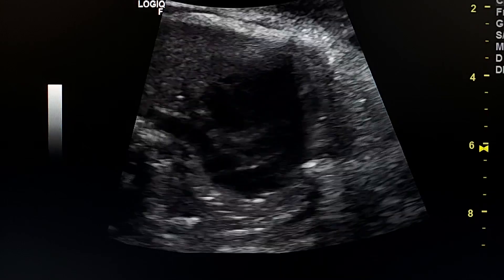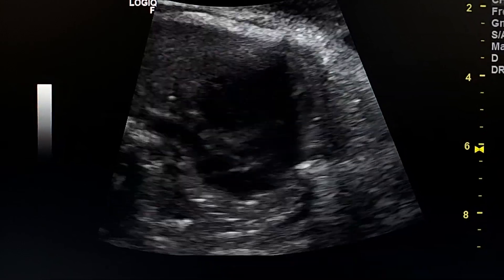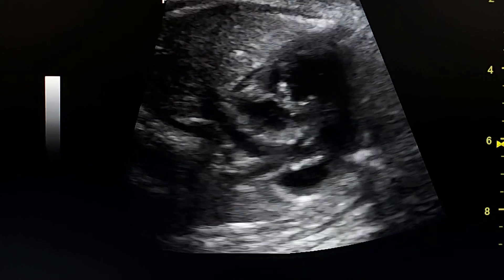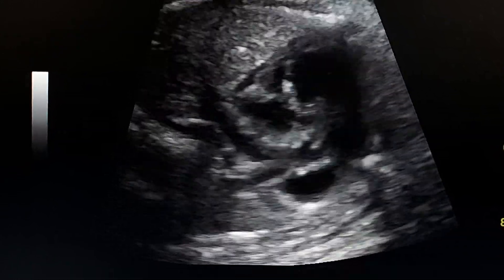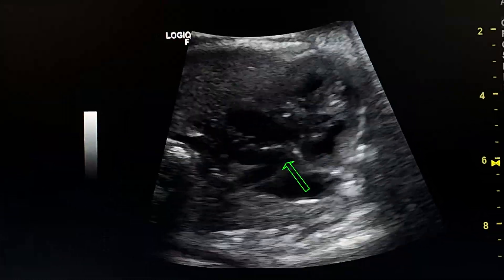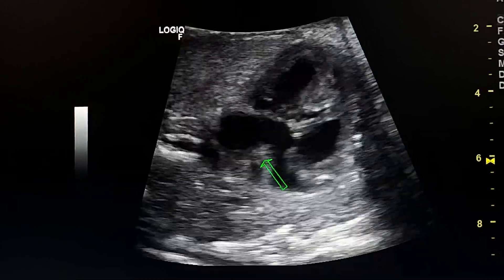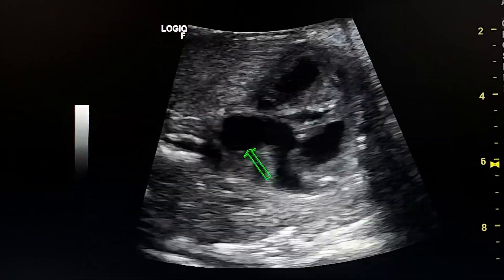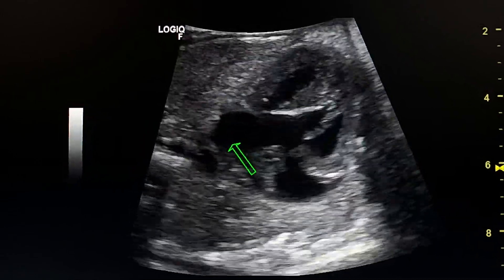This is the outlet of the right ventricle. We see the main pulmonary artery and its bifurcation.